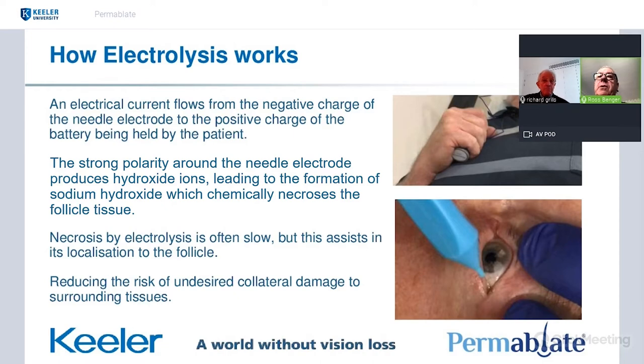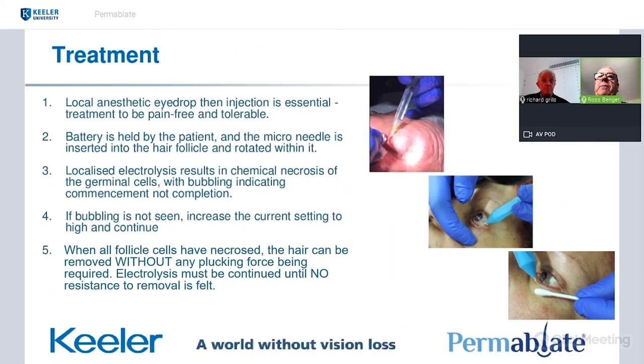Compared with other methods, it's slow — it may take a minute sometimes to get to the point where every follicle cell is ablated. But if you're going to do it, you have to do it long enough that complete necrosis in the follicle occurs. The beauty of it being slow is you have time to test and check that you're not doing damage to surrounding tissues. We'll show you this in the video shortly.